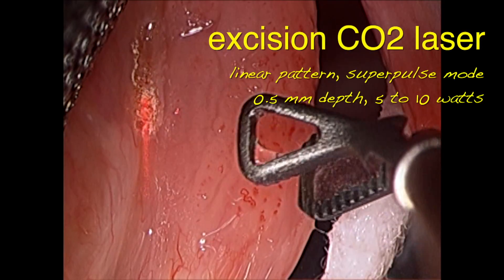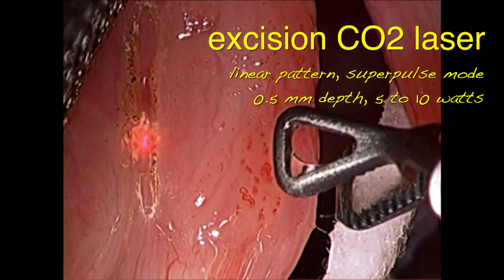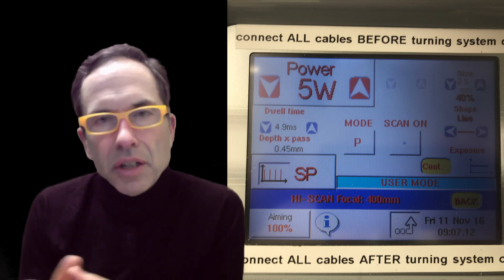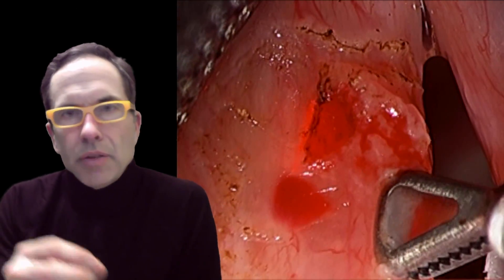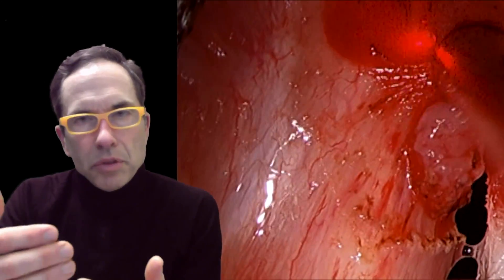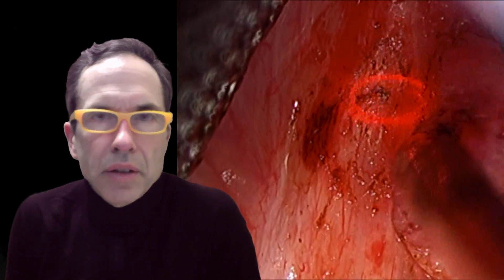I set the CO2 laser to a linear pattern drawing a straight line several millimeters in length, using super pulse mode — high energy, very short duration pulse — so I get mostly cutting rather than burning. I typically set the depth for 0.5 millimeters, which is usually enough to get through the mucosa in one or two cuts. My power setting is usually 5 watts, occasionally up to 10 watts. I gradually mark out the margins of the lesion, grasp the tumor and retract it medially, peeling and stretching the lamina propria between the muscle and the tumor. I'm able to preserve many of the blood vessels running through the lamina propria. In the event of bleeding, I can switch the laser to a scanning cloverleaf pattern, which creates a light burn on the surface to coagulate blood vessels.